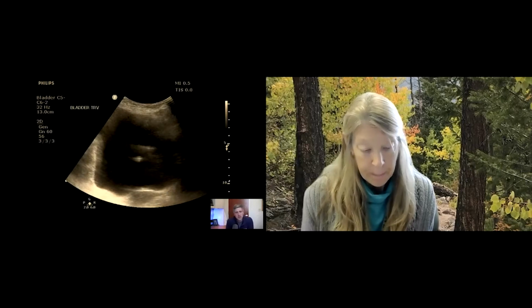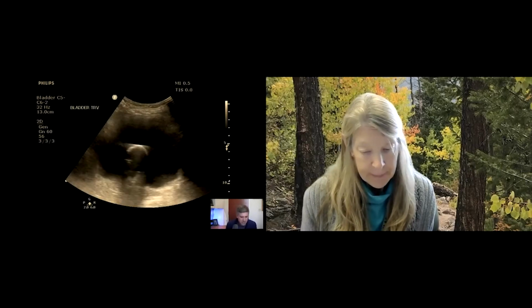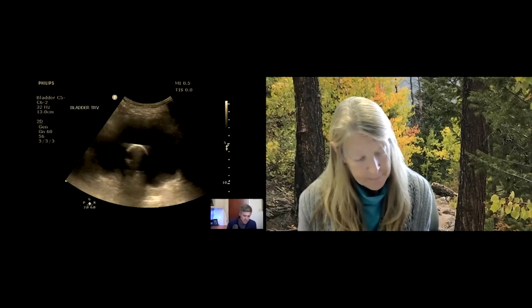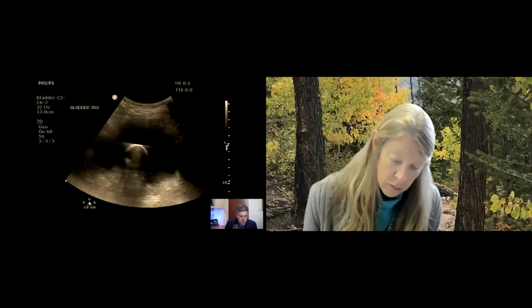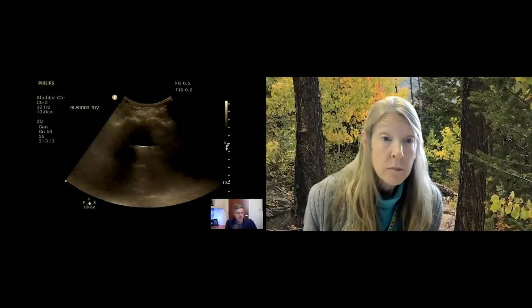And we can even create a third scenario, like let's say we have this patient where the Foley is definitively inside the bladder, and we have a full bladder. Well, maybe now you have a problem with your Foley itself, not just the placement, but maybe you have an obstruction inside the lumen of the catheter. So different ways that the bladder ultrasound can help you troubleshoot some of the problems that you may find with a Foley catheter.